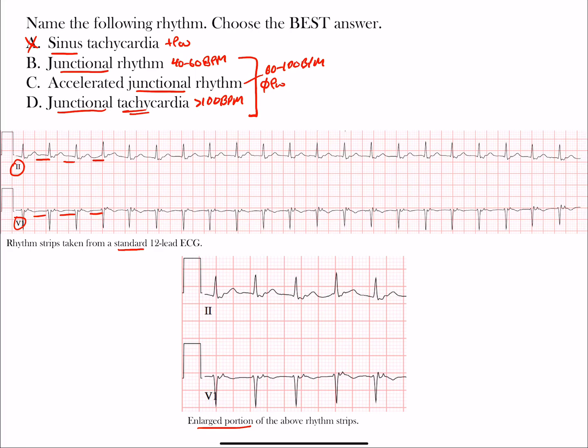If the rate was less than 40 beats per minute in a junctional rhythm, that's called junctional bradycardia. Notice it's less than 40 beats per minute, whereas sinus bradycardia is less than 60. This is based on the intrinsic rate for the AV junction.